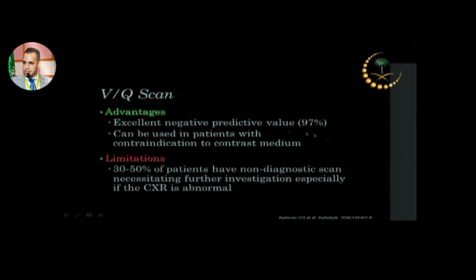A VQ scan has an excellent negative predictive value and can be used in patients who have contraindication to contrast media, but unfortunately up to 50% of patients have a non-diagnostic scan, especially if the chest X-ray is abnormal.